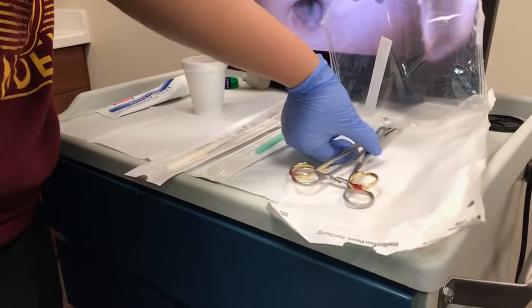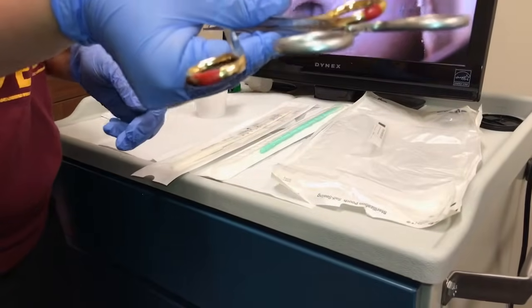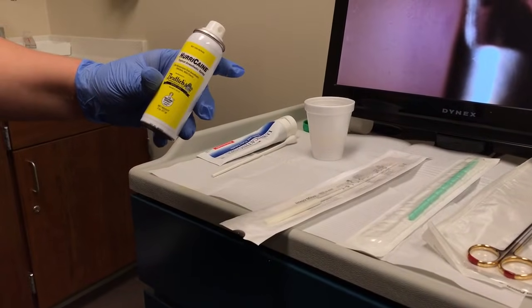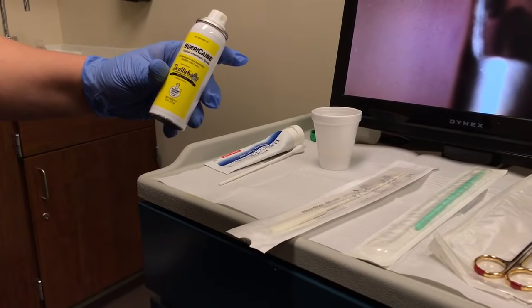After the provider applies the betadine solution onto the cervix, the medical assistant will then hand off the teneculum and eventually the scissors. Before the provider places the teneculum onto the cervix, they will spray hurricane spray and let that sit while they are putting on their sterile gloves.